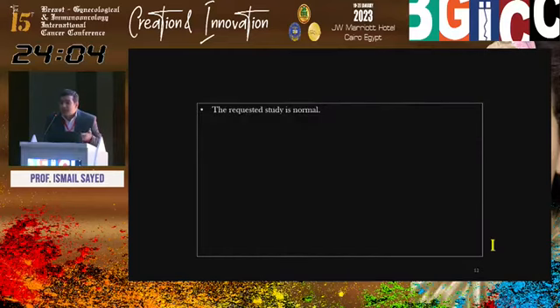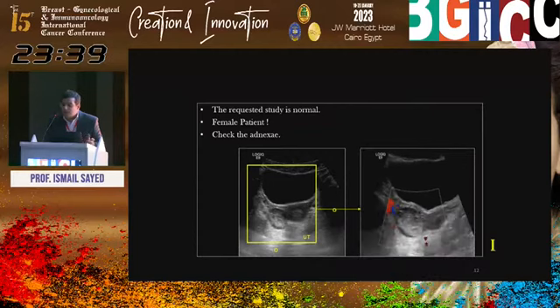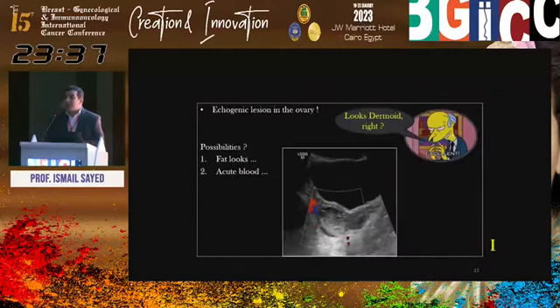Trace the adnexa. Ask about last menstrual period. She is a female. Last menstrual period was 2 weeks ago. So I am suspecting corpus luteum or hemorrhagic cyst, something gynecological. Okay, what about the right adnexa? Echogenic lesion measuring about 4 centimeters. No vascularity. The most common lesion, dermoid. So most likely dermoid. Every radiology resident will say dermoid.